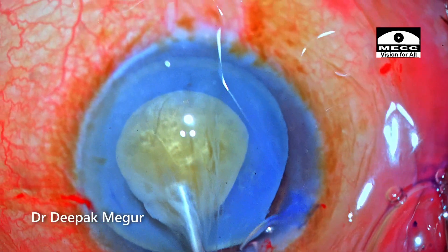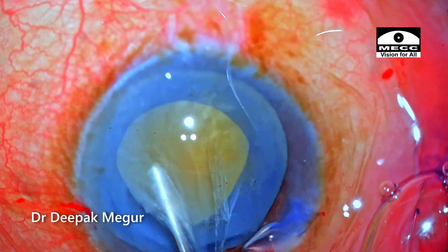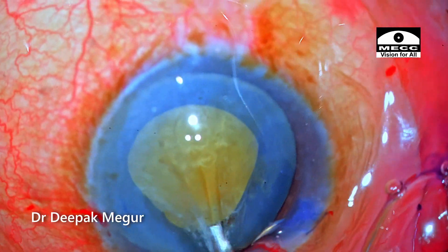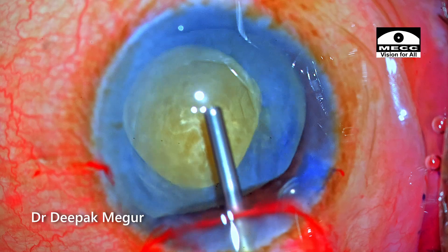The challenge is going to be dealing with the mobile nucleus in an empty bag. Since the zonules are very healthy here this case should be all right, and the main challenge is going to be dealing with this mobile nucleus and how we are going to divide it.